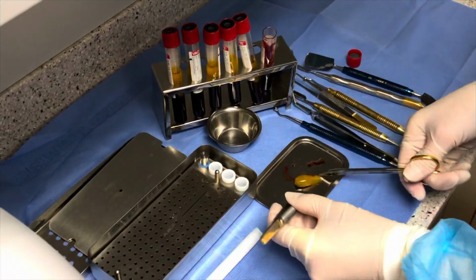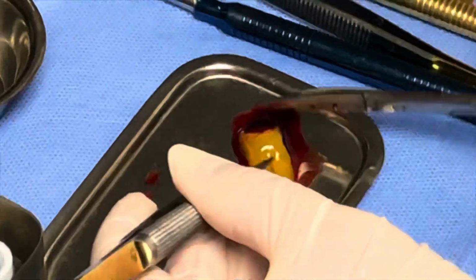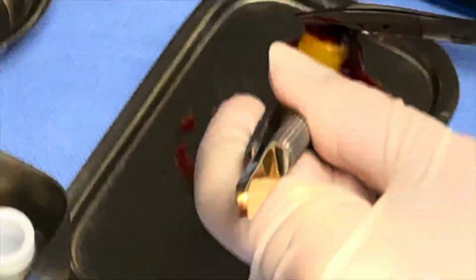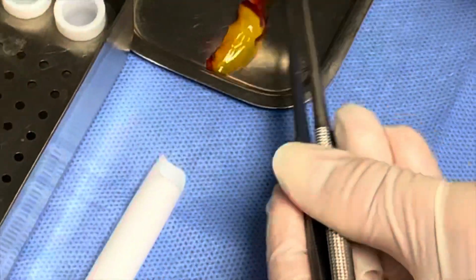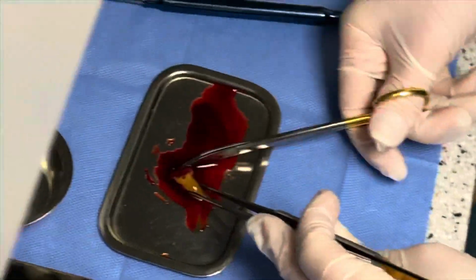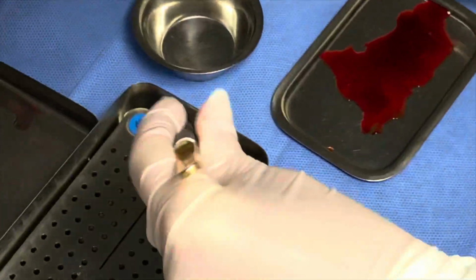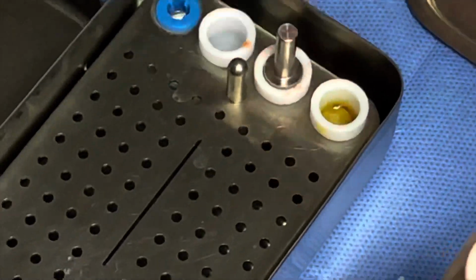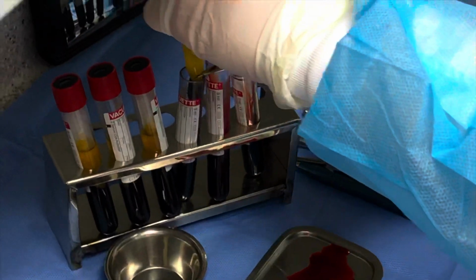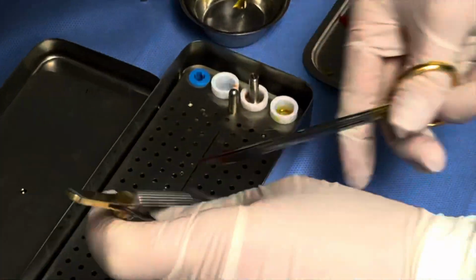Here's a fast forward video of our staff member preparing the PRF and processing it so that we have both plugs and membranes. Some of this will be mixed in with the particulate graft. In this case, I'm using Cerasorb, which is a beta tricalcium phosphate.